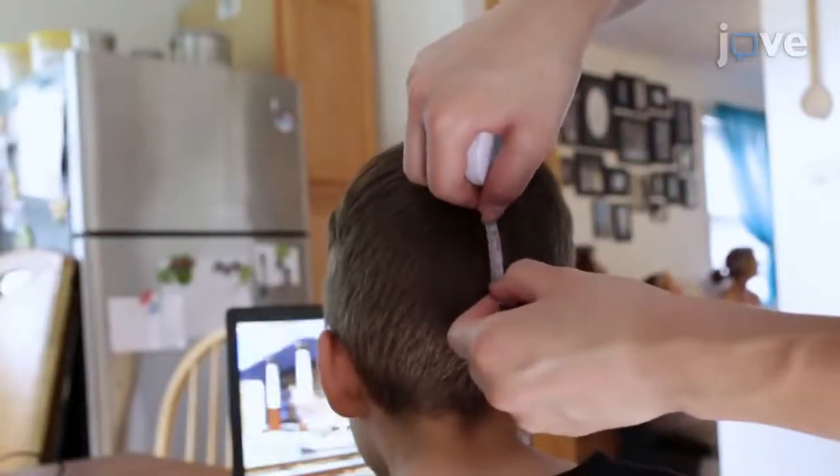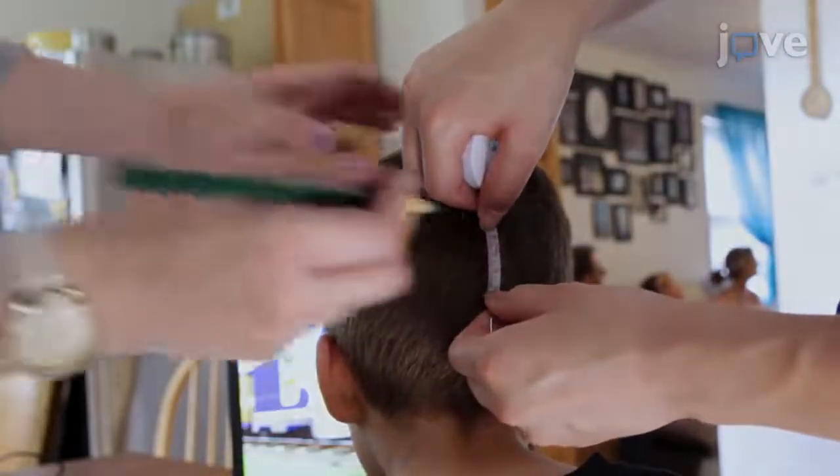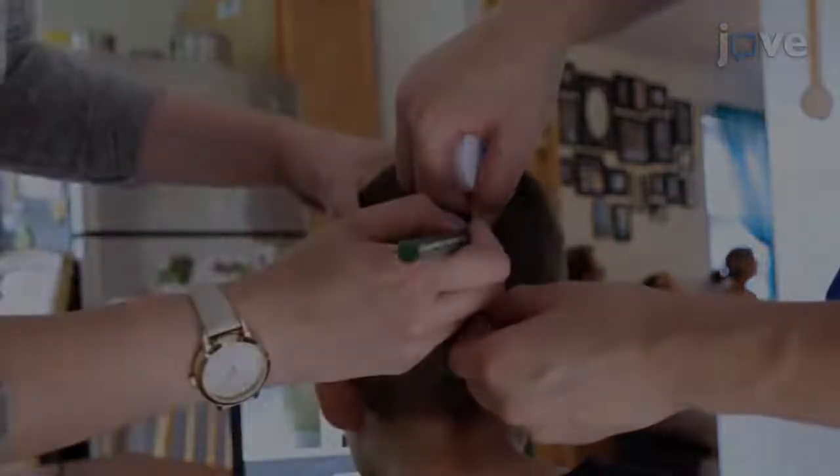Measure 10% of the inion to nasion distance up from the inion and 10% of the preauricular notch on one ear to the left.